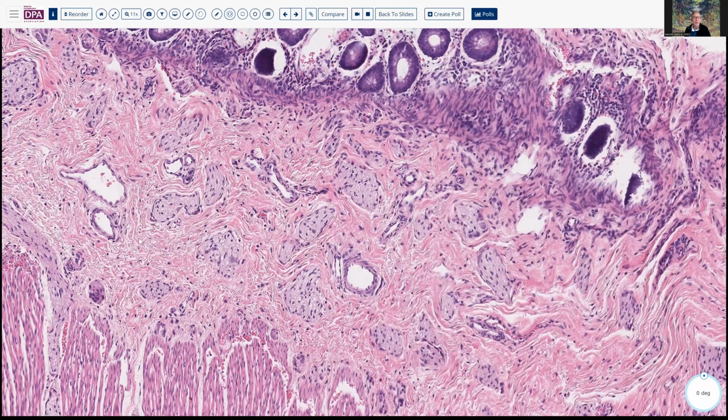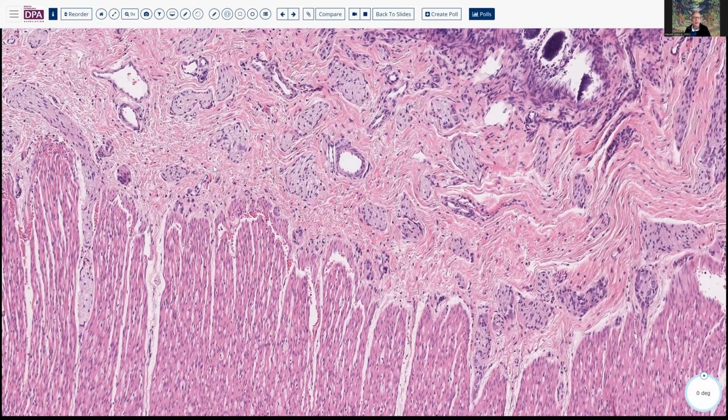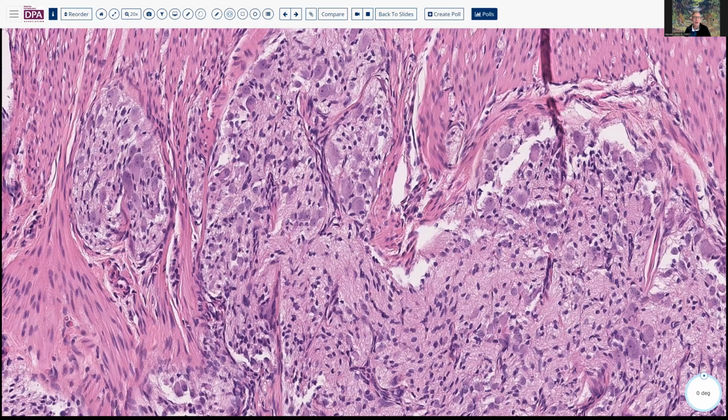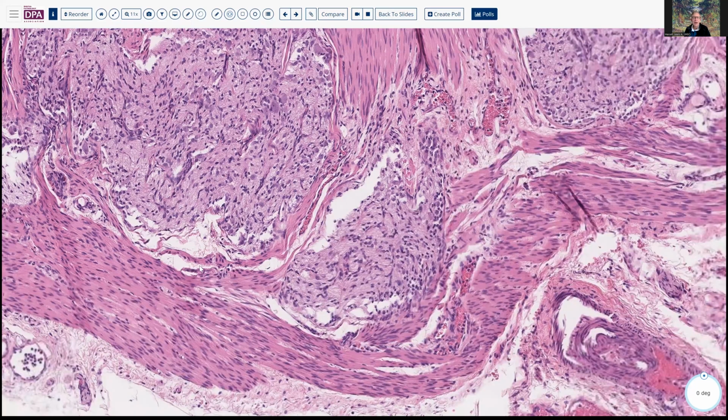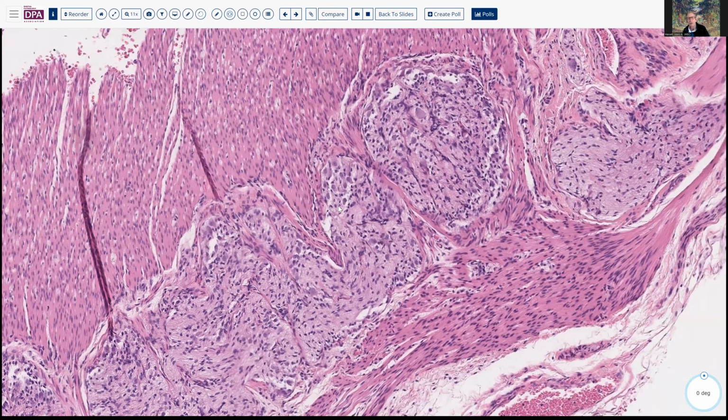Looking then into the muscularis, we see one of these nerve bundles coursing down between the fibers. And then as we get in between the two layers, we see these prominent areas of neural or glial type tissue with abundant numbers of ganglion type cells, which you can see here have eccentric nuclei and amphophilic appearing cytoplasm, and they're just coursing here in between these circumferential and longitudinal layers of the muscularis, forming quite a hyperplastic appearance, or almost hamartomatous. In fact, clinically in this situation, they were causing a bit of mural constriction and abnormality, giving the impression of a clinical mass lesion.